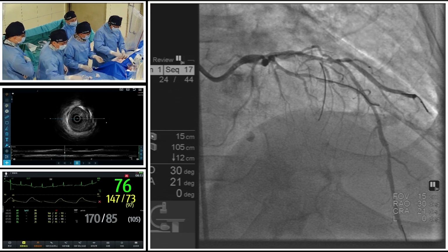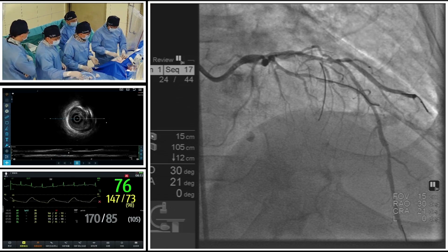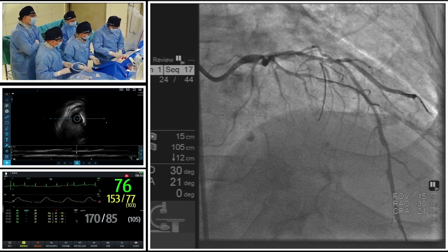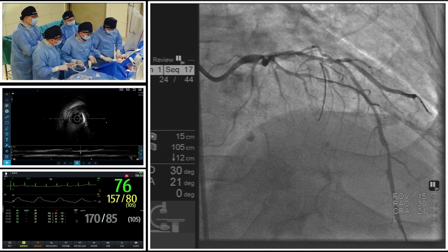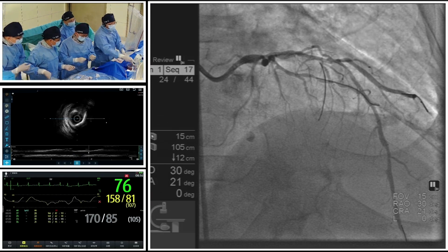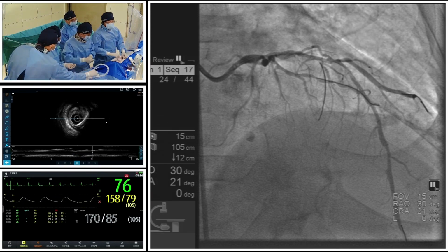However, with the help of the debulking technique of rotablation, using rotablation to reduce the plaque burden and also the plaque volume at the trunk of the left main bifurcation is of great importance in this case.